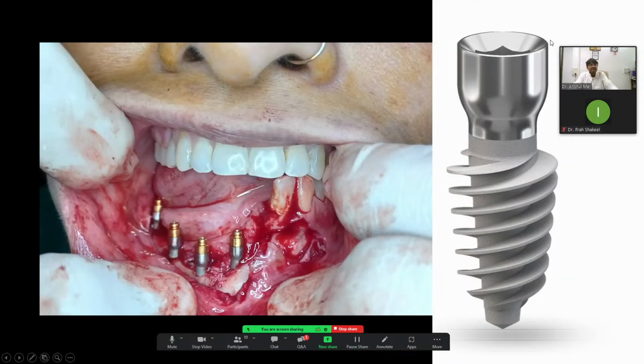Half of the implant is polished; it is a cortical implant. We place this implant on the available bone, and half of the interarch space is covered with the implant and half with the abutment. So my crown-to-tooth ratio will not alter, and the fulcrum of my lateral forces will be on the small screw, which is very nearby. So it avoids screw loosening of the prosthetic.